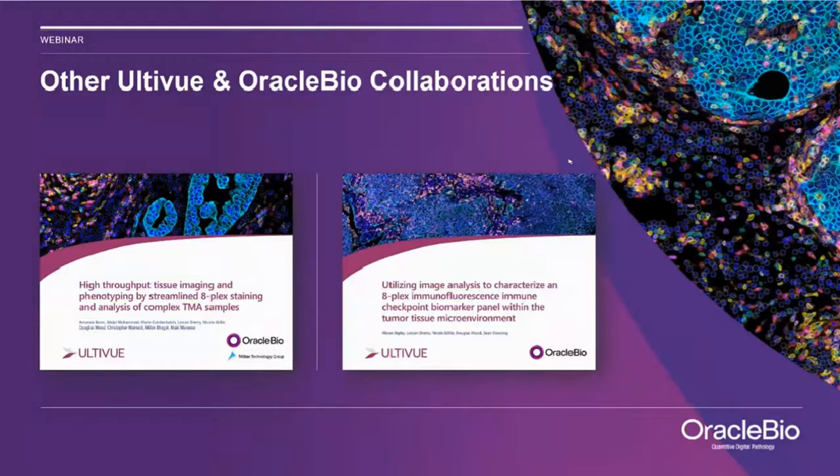Great, thank you. And how can you run the H&E without interference between eosin and fluorescent dyes? We are all aware of the fact that eosin has some fluorescence and gives some signal. But what we do is perform the H&E after the multiplex IHC staining, and we can easily do that, especially because, as I mentioned, we only perform one single antigen retrieval step.